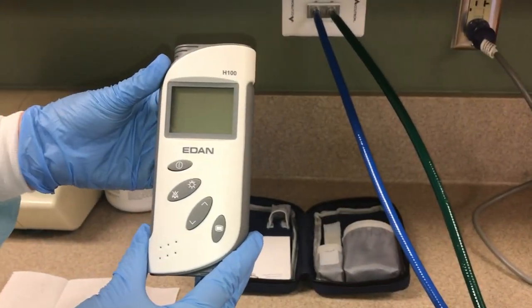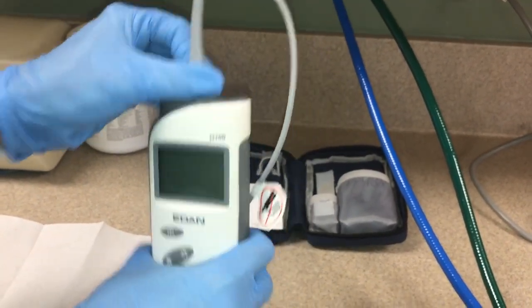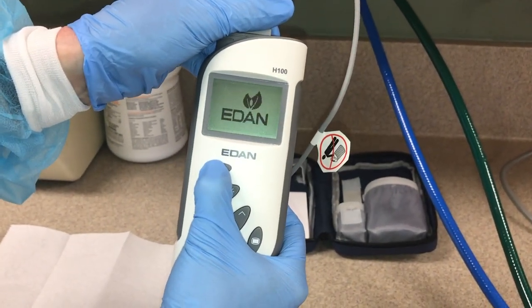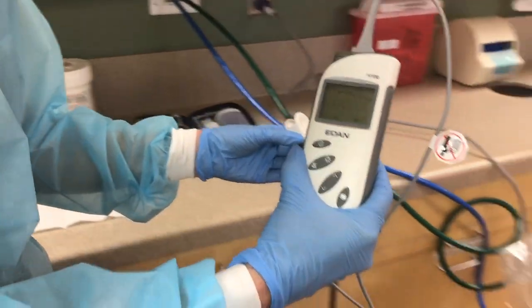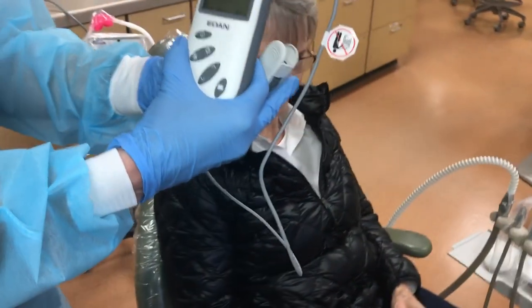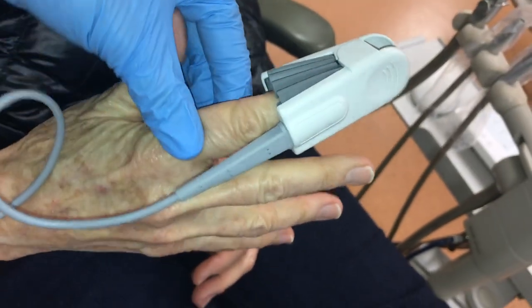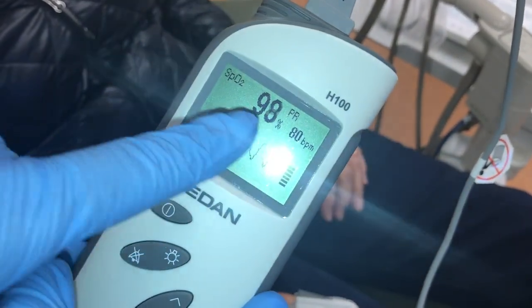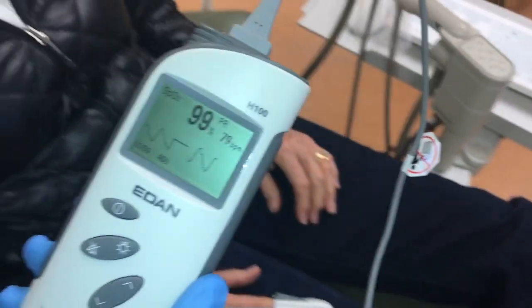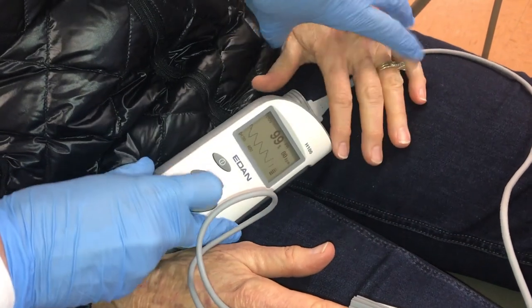The next piece of equipment is the pulse oximeter. You will need to attach the power cord to the top portion of the unit; this unit is run by batteries. Once you depress the on/off button, you will notice words on the screen if the batteries are running effectively. You will then take the finger adapter and place it on the patient's index finger. Note that there is a small graphic on the finger adapter to assist in placement. On the screen of the pulse oximeter, you can see the oxygen saturation and the patient's pulse. You will take three readings during the procedure. Please have the patient hold the unit in their lap so it is visible for the clinician at all times.